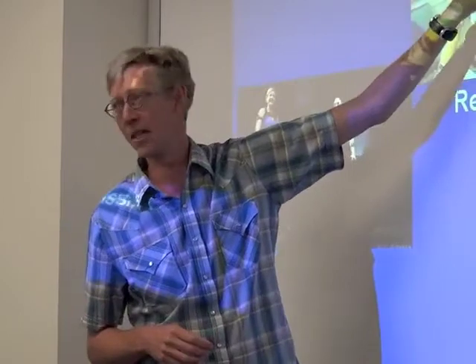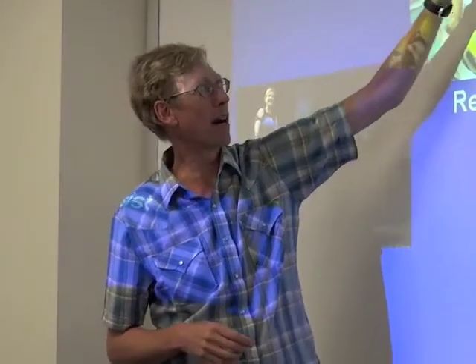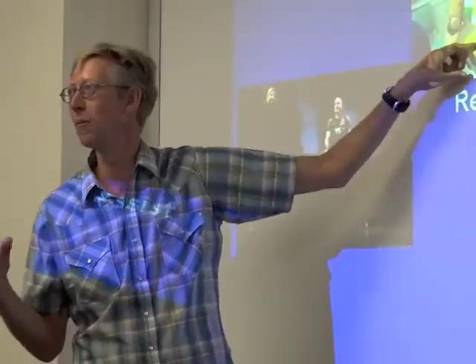And so now what happens when the guy says, hey, open my hand, what happens physically to him? Question for you guys. Yeah, so then he says, open my hand, and a little bundle of pectoralis muscle contracts. Okay, and so you can see now they put electrodes over this. So they're using the muscle as a biological amplifier. They put electrodes, they can detect that, and then this gets processed and then actually causes the robot hand to open.